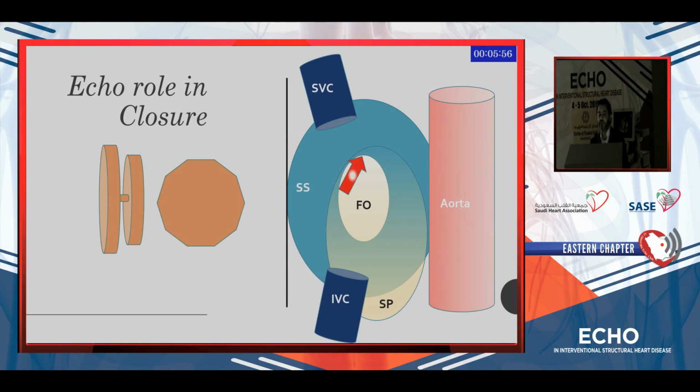So the device will be somewhere here between the 2 membranes. This is where your device will be located, between the septum secundum and septum primum. You need to make sure that your device is big enough to have a good grip of septum secundum and septum primum.